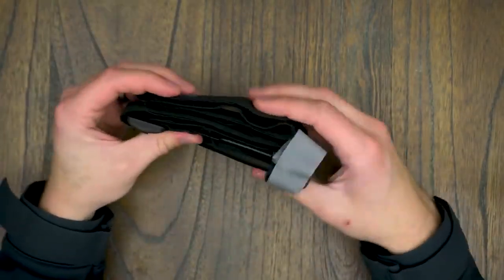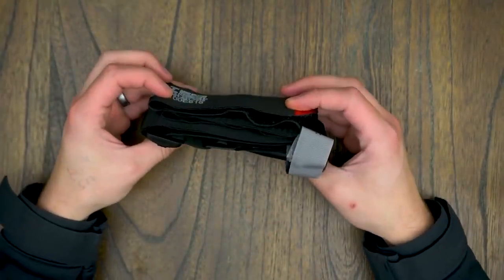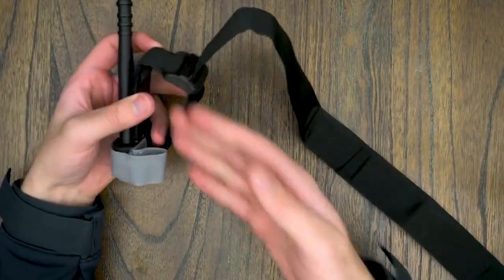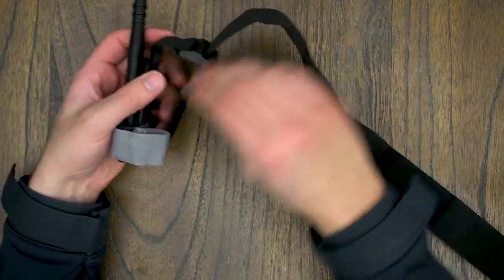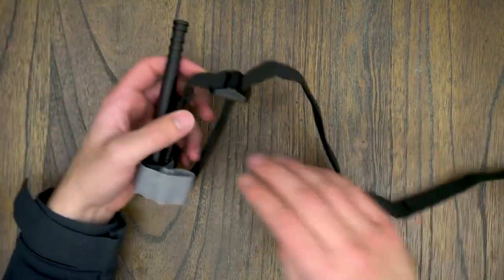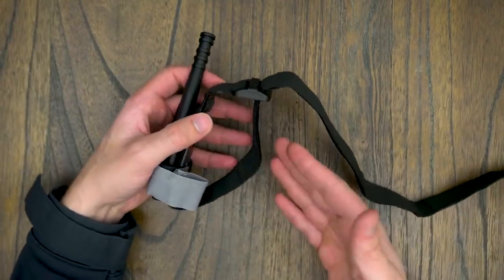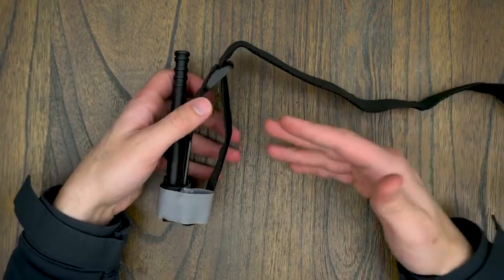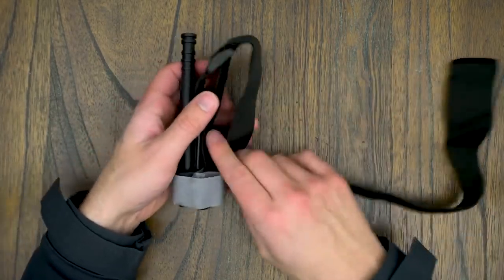At first glance, this looks very similar to how it was staged earlier, except that if you need to put this on, you have nothing. You have a very small opening to get in there, and you've got this really long tail. So putting this on your arm or your leg is going to be a lot harder than if you could just open it and have it the correct width. So this is the first mistake I see people make a lot.